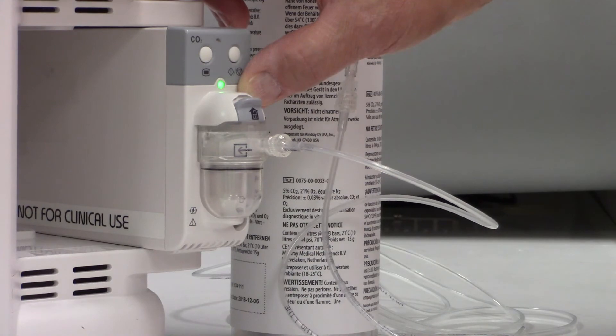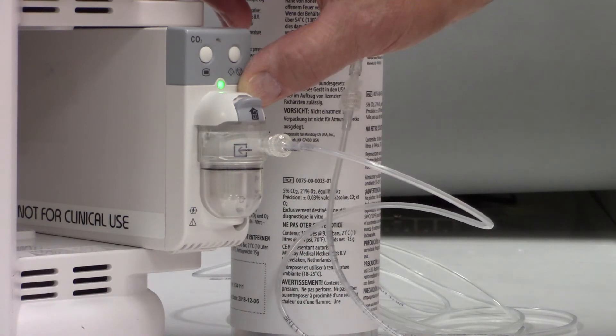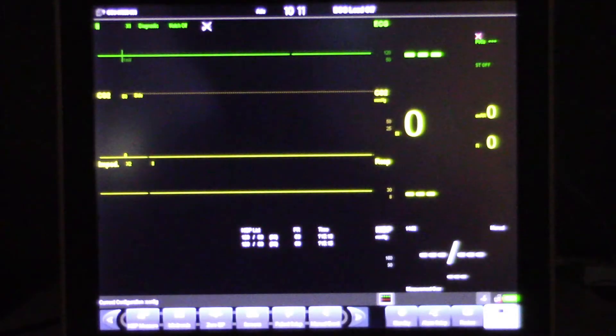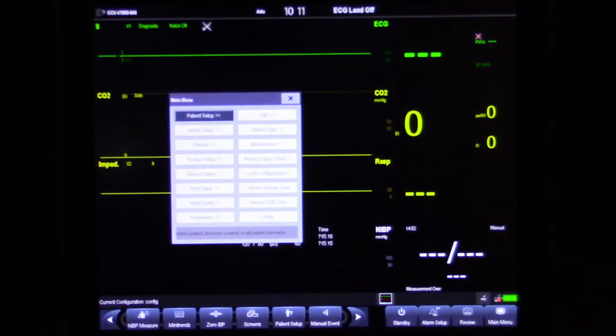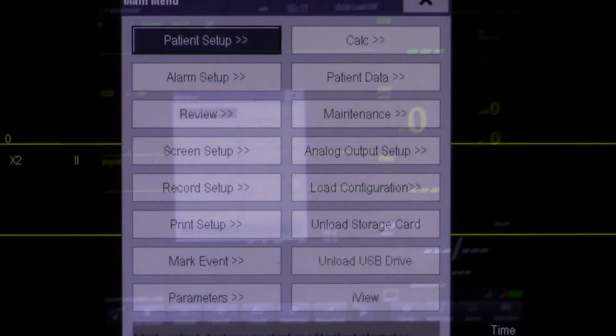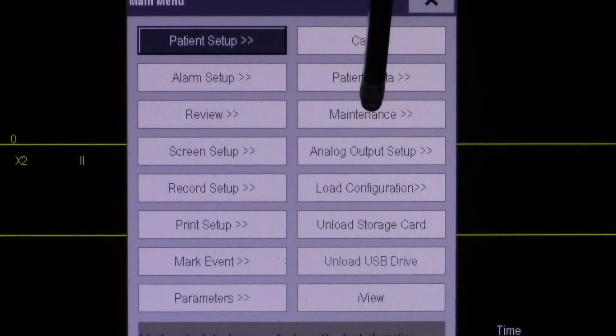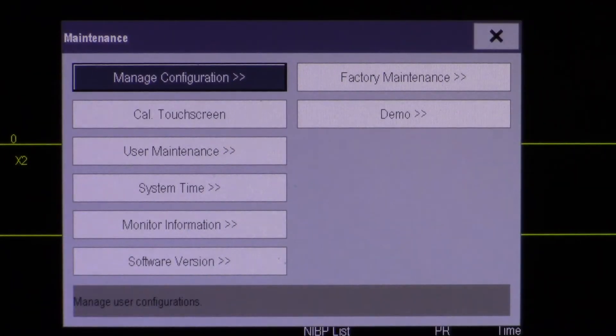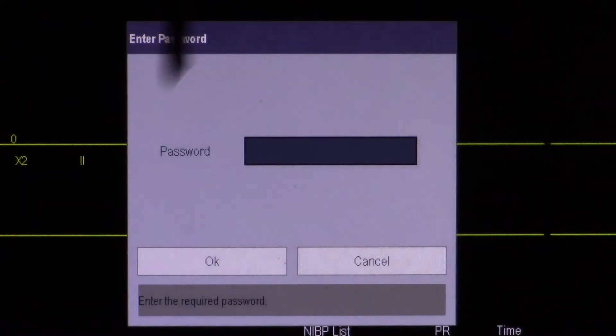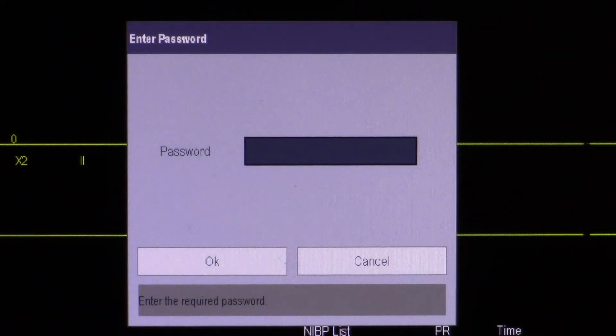From here, we will navigate through the user interface to start the calibration process. To begin, touch the main menu in the bottom right-hand corner of the screen. Select maintenance, user maintenance, touch the password field.